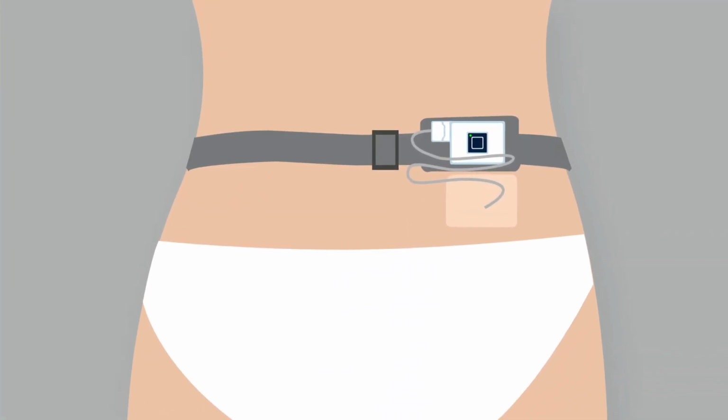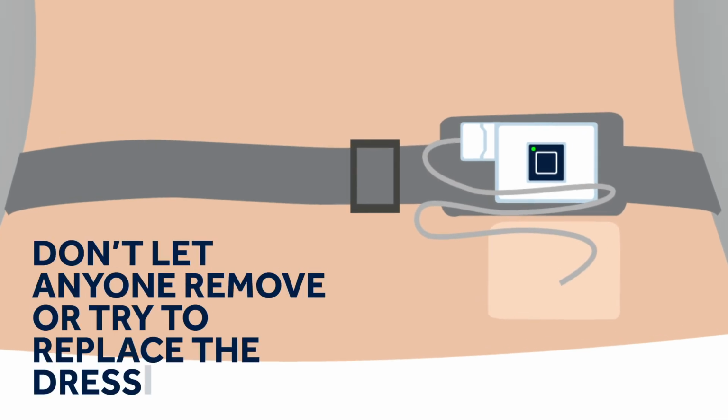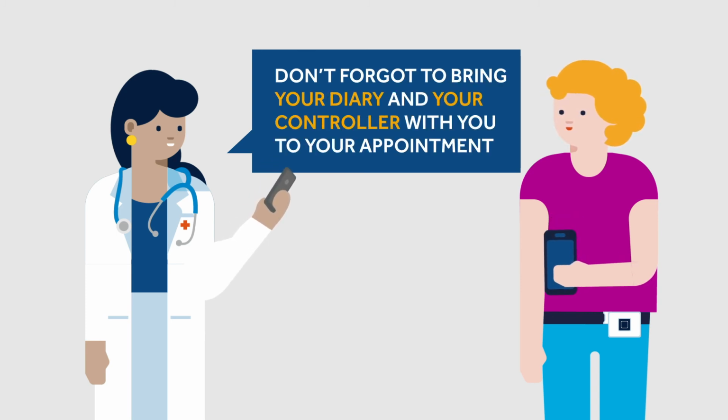The dressings on your back are helping to keep the wire in position, so it is important that they remain in place. If they come loose, simply stick more dressings over the area. Avoid getting them wet. At the end of the evaluation phase, you will meet a member of your clinical team to review your diary, to check if your symptoms have improved, and decide if the therapy is appropriate for you.